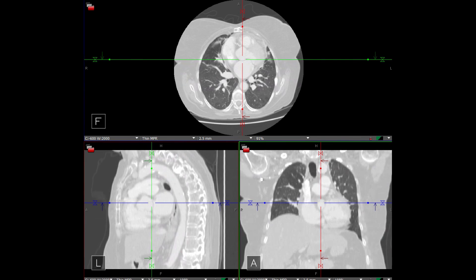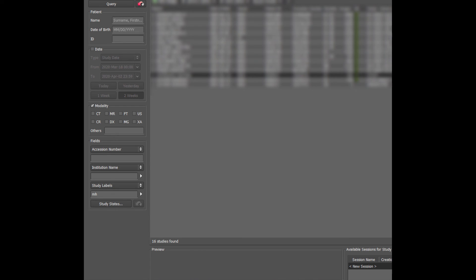That's a quick overview of the congenital lung abnormalities. The ones to really think about are bronchial atresia, which presents with air trapping and a central either mucus-impacted or aerated bronchus not connected to the normal bronchial tree, and sequestration, where you have systemic arterial supply to a lung parenchyma.